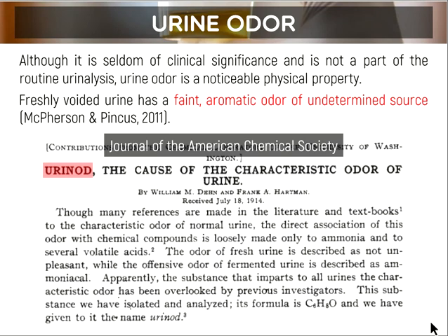Lastly, we have your urine odor. Although it is seldom of clinical significance, it is a noticeable physical property. Especially with those with UTI or infections, the urine smells very noticeable.